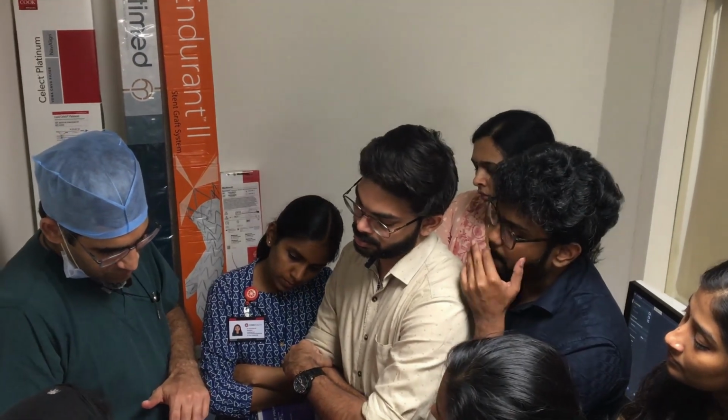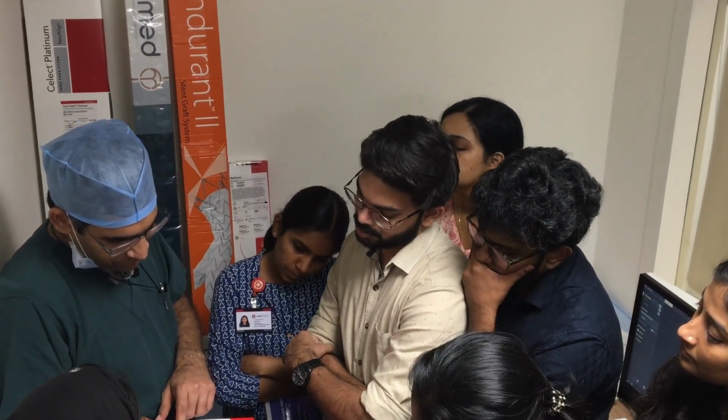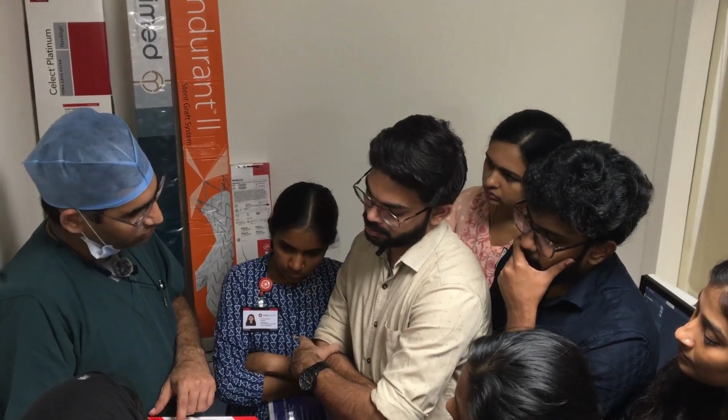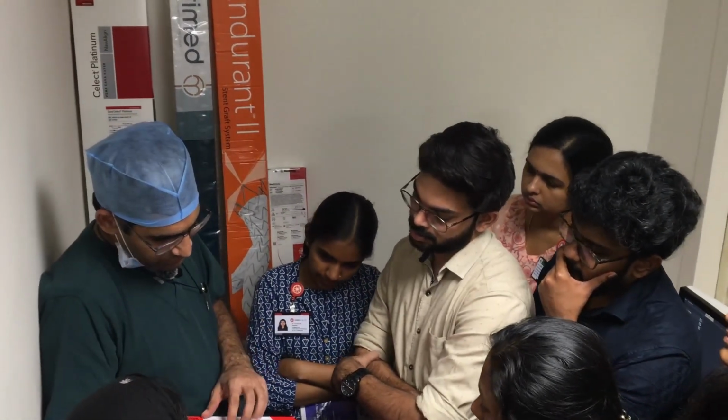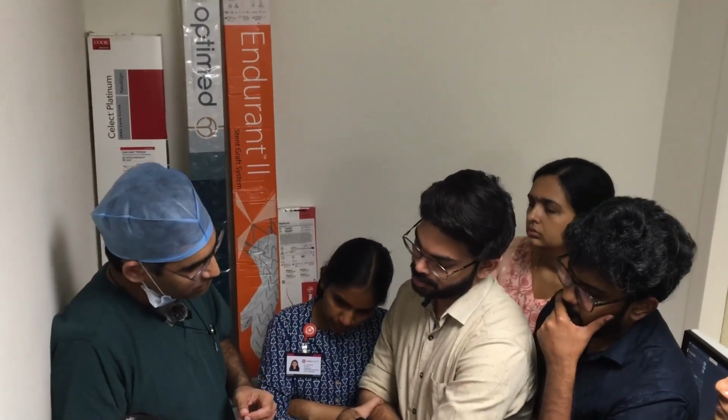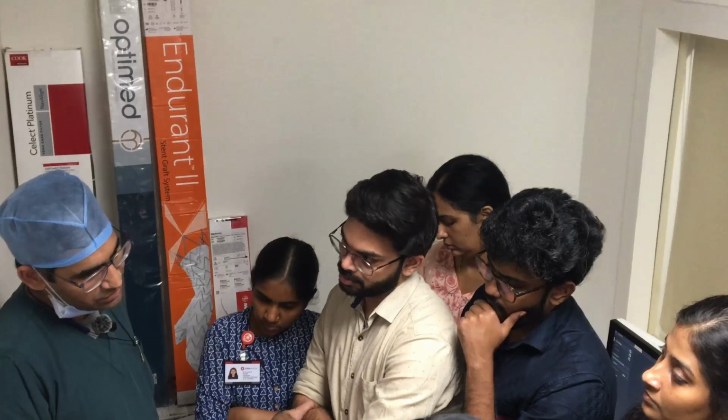So you can see this is a 12 balloon. At nominal, it is 11.98. If you go to 14, it will go to 12.25. So the increase is very slight. And 14 is the burst pressure. So every balloon will have its burst pressure. More than that, it will burst.